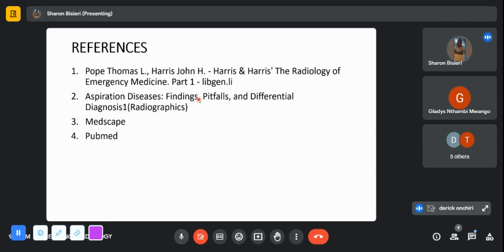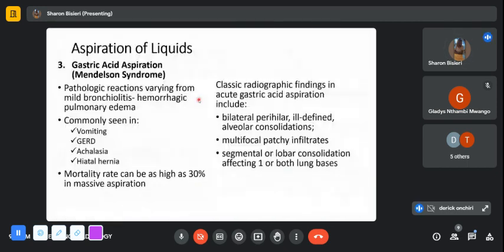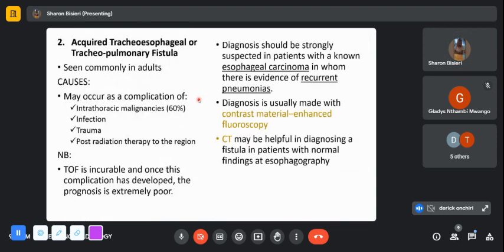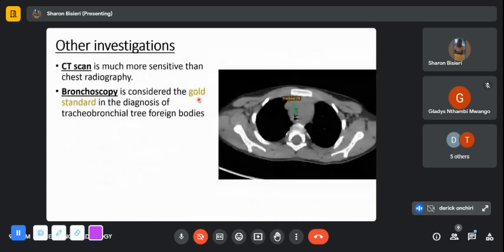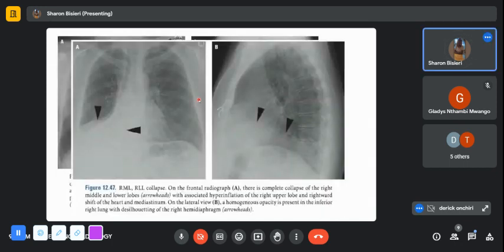I was reasoning about the chest X-ray. I know we are doing a lot of chest X-rays downstairs: PA, AP, adult, newborn. At what point... I know most of the indications for a lateral chest radiograph would be for evaluation of retrosternal and retrocardiac opacification, as well as localization of opacities and maybe pleural effusions. But which are some of the indications we can really pursue?